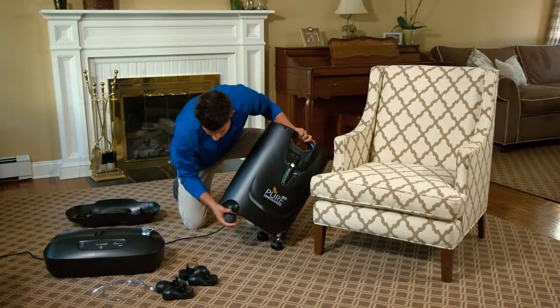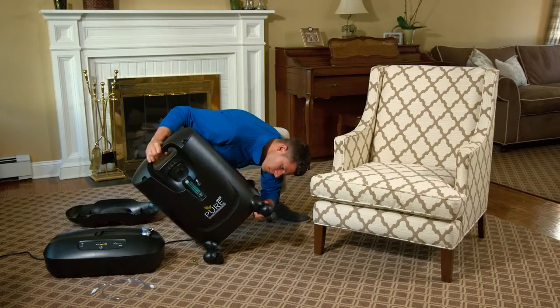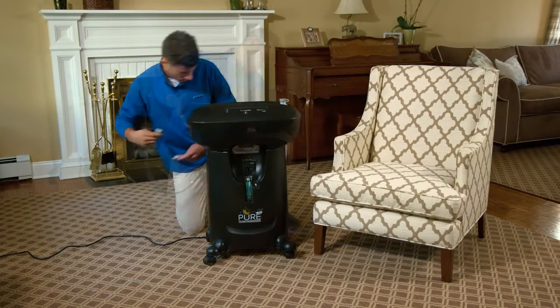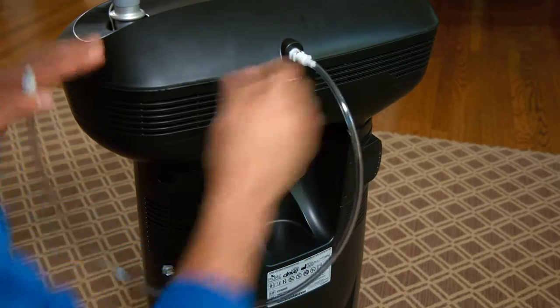Your provider will set up the PureFill, utilizing the adapter kit, which includes the footplate adapter and the caster wheel extensions. They'll also connect the supply tubing.